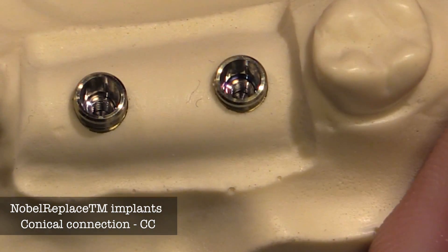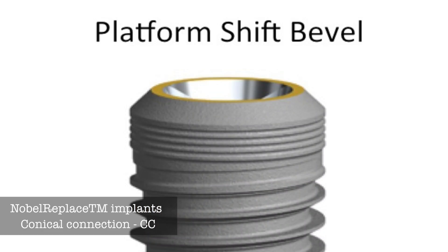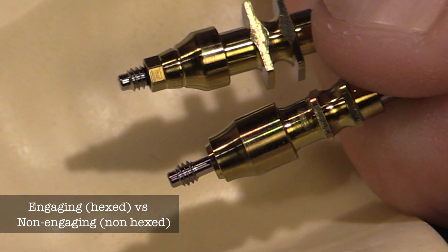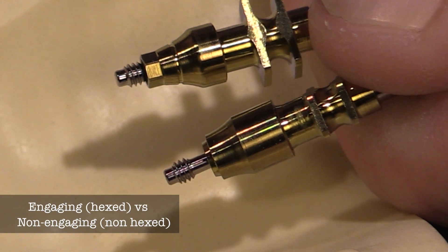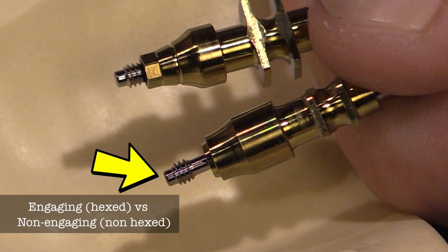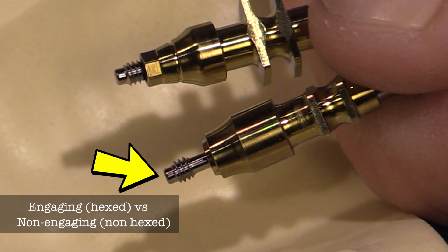Looking at the Replace CC implant from Nobel Biocare, you'll notice that it has a platform shift on top plus the 45-degree bevel. This is important when picking out your impression coping, because some impression copings will go down inside of the implant — these are called engaging impression copings — while other ones will sit just on top of the flat aspect of the platform shift, as shown right here.